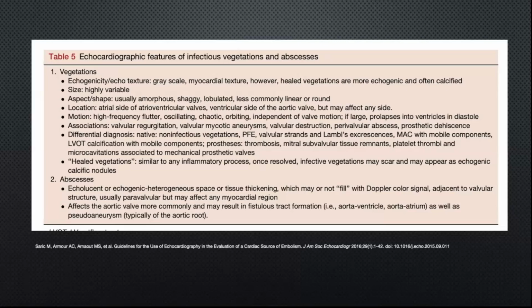And in terms of abscesses, going beyond just the valve inclusion itself, you can see an echolucent or echogenic heterogeneous space or tissue thickening, which may not fill with Doppler color because it's not vascular.